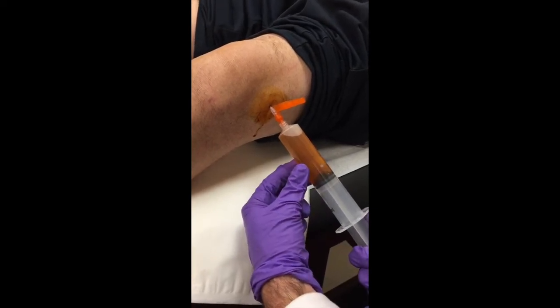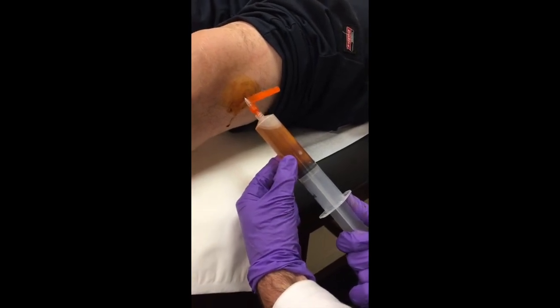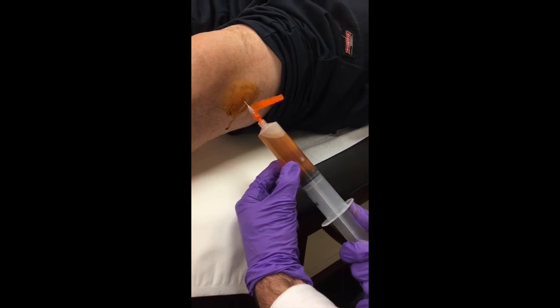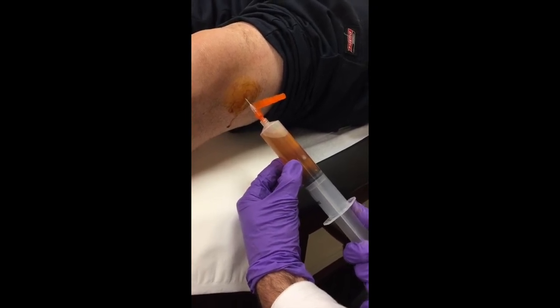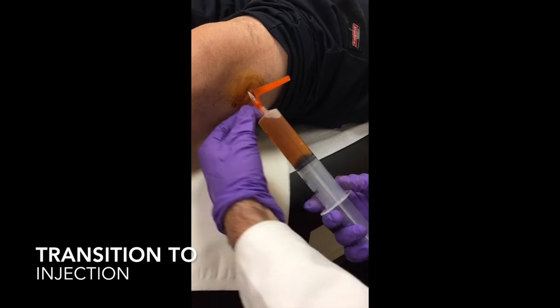I'm going to create constant pressure with my right hand pulling the syringe back, slowly pull the needle back, and see if I can get a flash of fluid. There's our flash — so now we'll proceed.